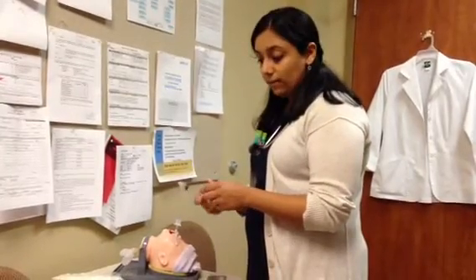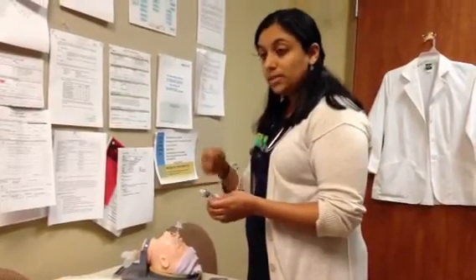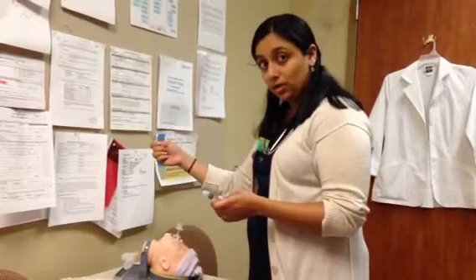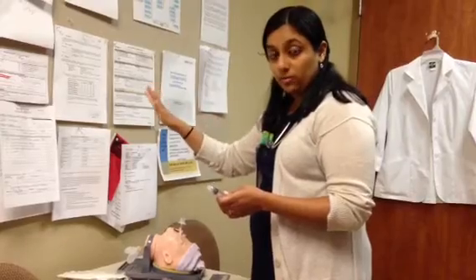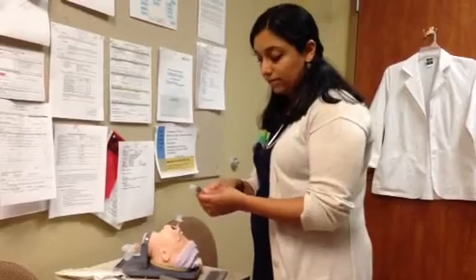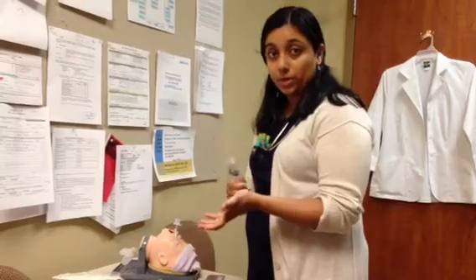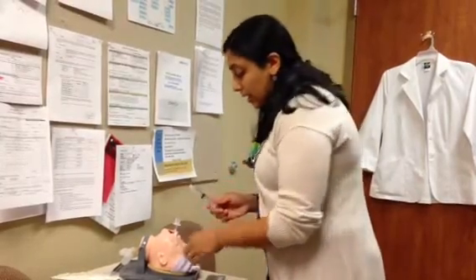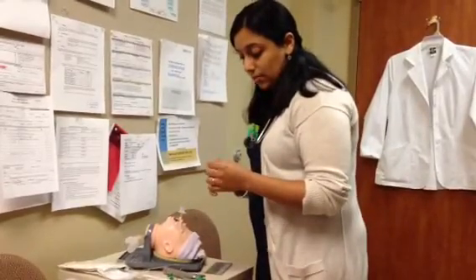You withdraw that into a 5 or 10 cc syringe with a needle, and then using a second sterile needle, you will withdraw the rest of the amount in the vial, cap that second needle with the extra surfactant, label it, and store it in the pharmacy so that you can use it on another infant down the road. And then that now empty vial can be sent with the infant. So withdraw the surfactant in the amount that you need. For this infant, let's say this infant is 2 kilos, and this is Infrasurf. So 2 kilos, 3 mLs per kilo. I'm withdrawing 6 mLs.